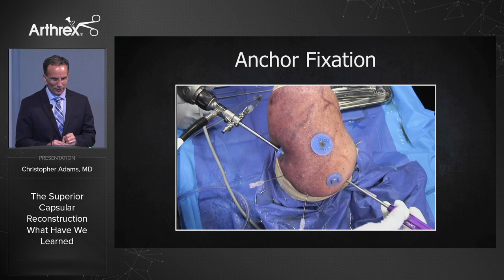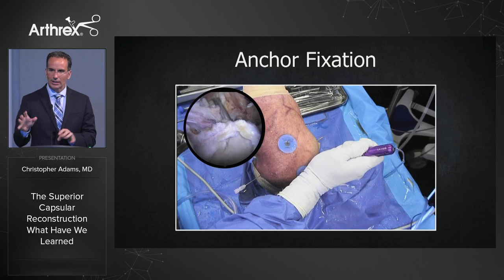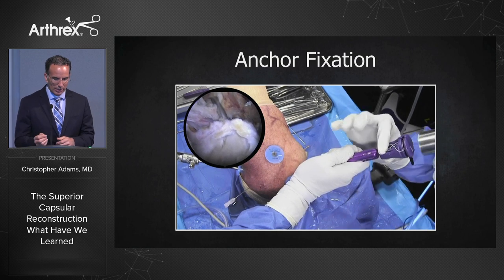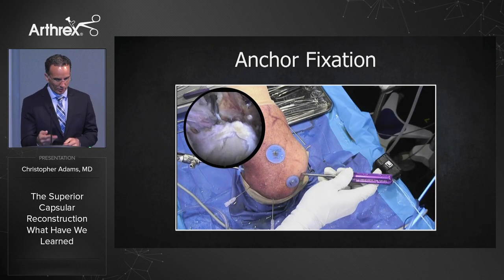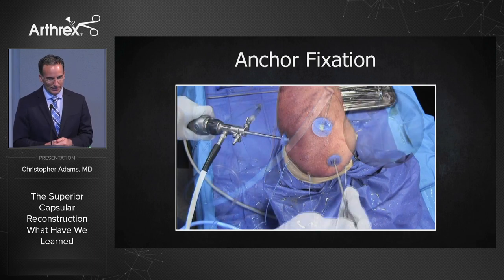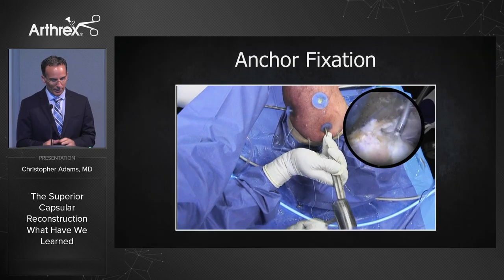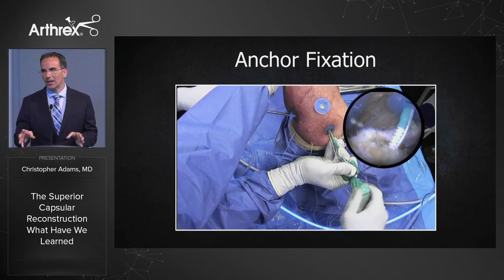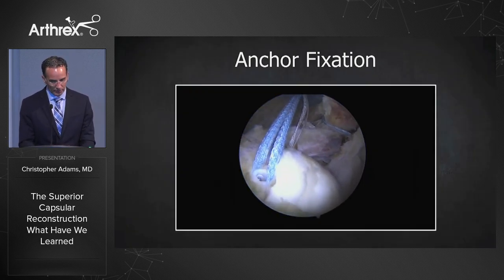We're going to show three knotless suture tacks. Inserting the drill guide — I like to tap it with a mallet to keep it stable and decrease the chance of skiving. Insert the knotless suture tack, take the little black tab away, and pull it straight out. Now the 12 and 2 o'clock anchors are done. On the greater tuberosity side, we place either a 4.75 or 5.5 biocomposite swivel lock anchor preloaded with either fiber tape or tiger tape. The beauty of this technique is placing all five anchors ahead of time, then passing all sutures through the graft later — it makes it much easier.